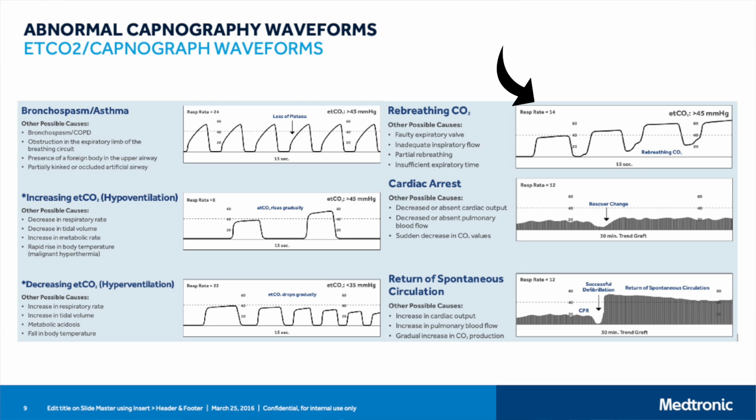If you do not ever go back to 0 during an inspiration, you need to assess your patient and determine why we are not at 0. What is happening? Why is he rebreathing CO2?